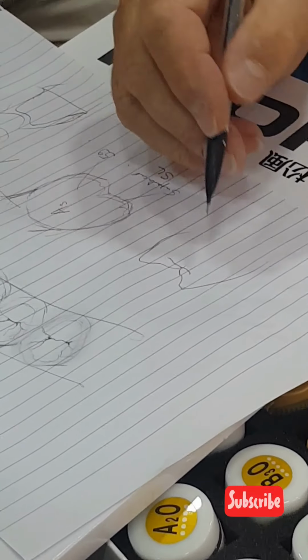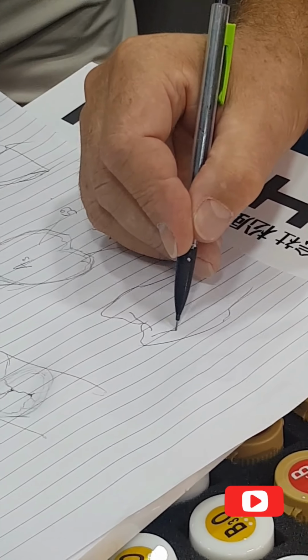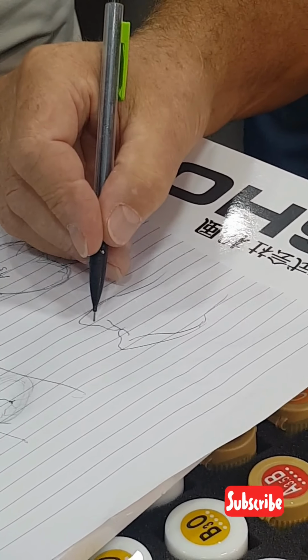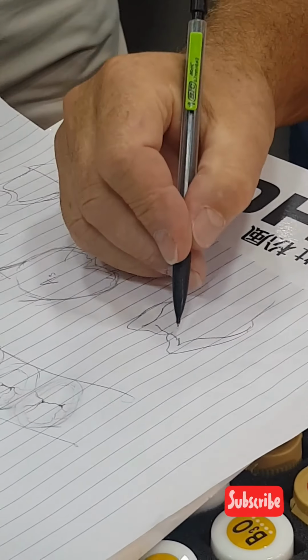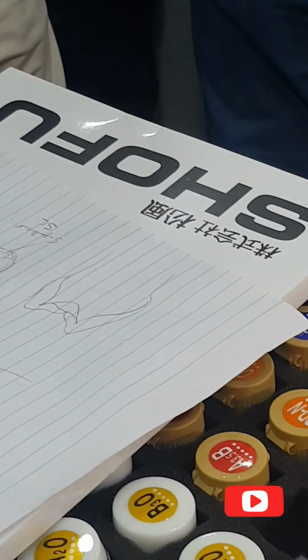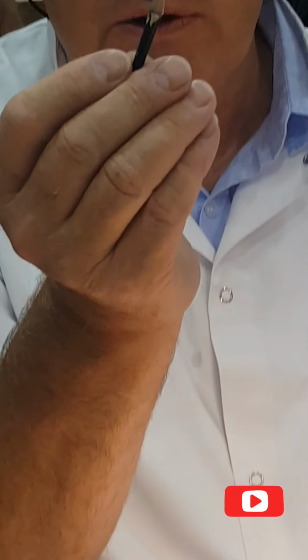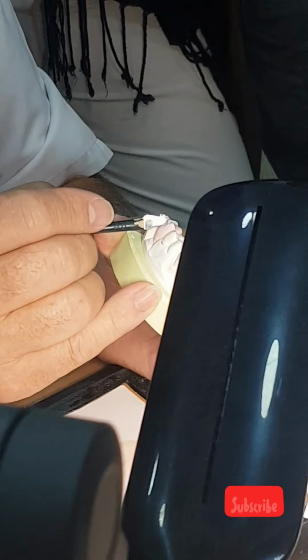And look, my small instrument. You remember this morning the shape? The shape of the dentine. The shape of the dentine in the natural tooth is concave. Concave. I don't invent something. That's the reality. And something like that. You remember the shape? I have to reproduce it. Why did I make that instrument? Because that instrument, if I do that, gives me concavity immediately.